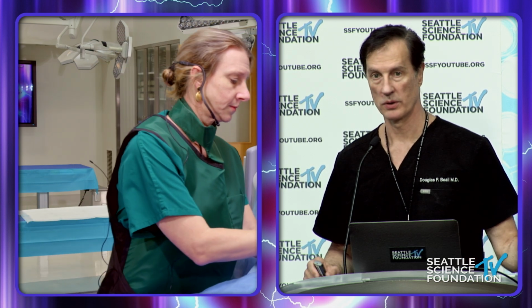Okay. I'm just wondering structurally, what is the loop surrounding? The question is, what is the loop surrounding? What structure? It's not. It's in the epidural space. So it's just strain relief loops that are designed to keep it in place. And what's keeping the DRG with the electrodes in place, it's the surrounding intraforaminal ligaments. So that has no problem staying in place once you get next to the DRG. Just so it doesn't pull out, you create S-shaped strain relief loops, and they just sit in the epidural space.